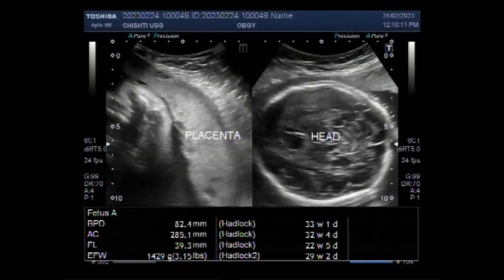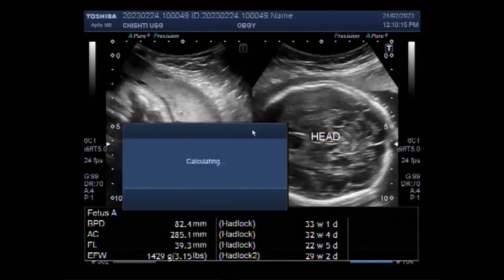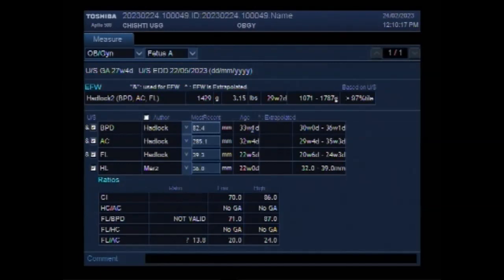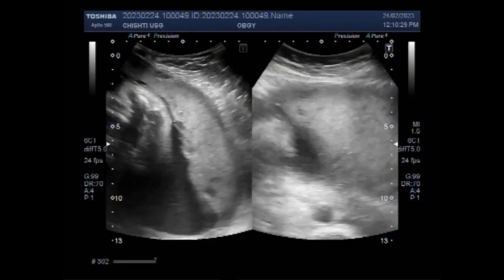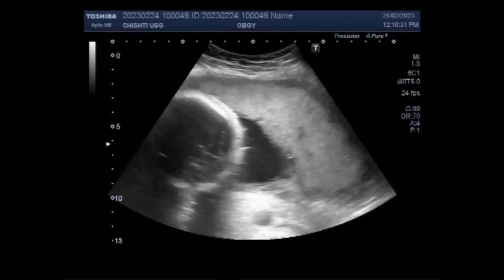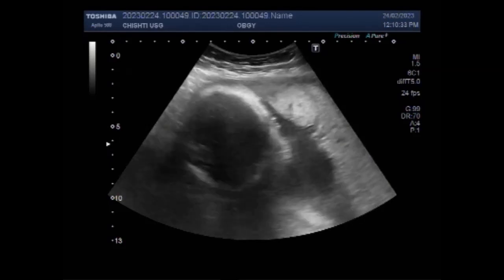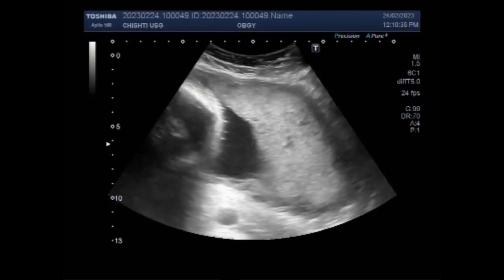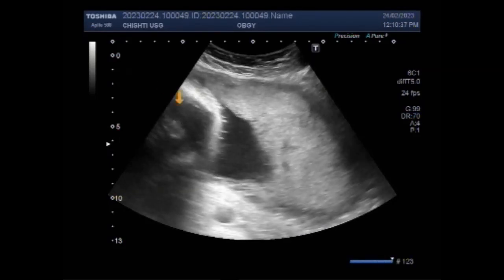Dear viewers, I hope you are all fine. This ultrasound video shows a case of fetal congenital limb deficiency. In this video you will see the fetus having both the upper and lower limbs of reduced size. The pregnancy measures about 33 weeks and you can see the placenta and the fetal head.